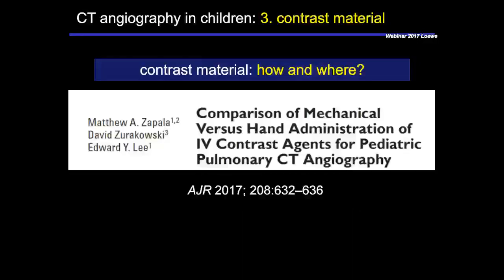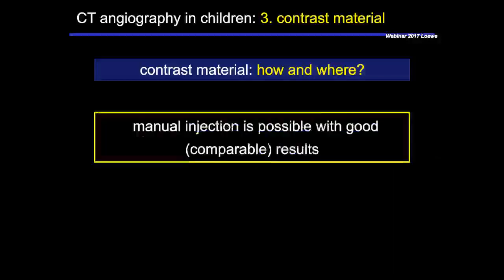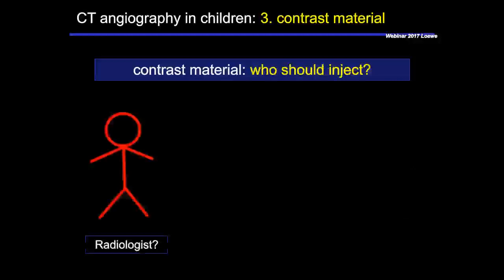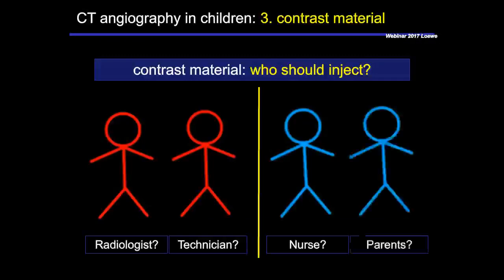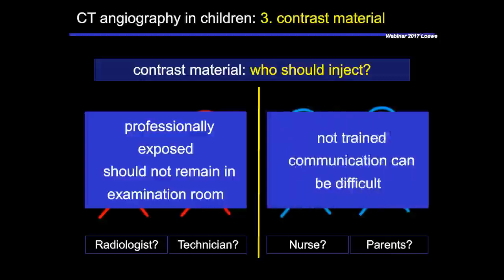Old question: should we go for a hand injection or should we use a power injector? Recently published, it doesn't make any difference from the view of the result whether it's done by hand administration or by a power injector. However, in my institution, if you have the manual injection, it's always the question, who should perform the injection? Should the manual injection be done by the radiologist or by the technician? Or should it be done by the nurse coming with the children or even by the mother or the father? Of course, the radiologists and technicians should not be the people to inject the contrast material, because they are professionally exposed, so they should not remain in the examination room. But the nurses are not trained, and sometimes the communication can be difficult, and there is some radiation fear even by the nurses or by the pediatricians, so they sometimes don't want to stay in the room.